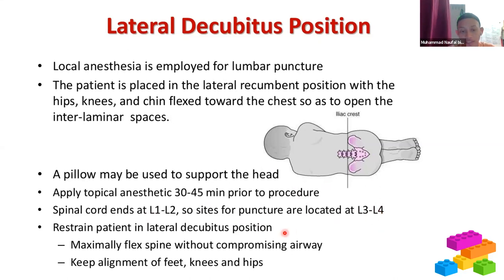And then restrain the patient in lateral decubitus position to maximally flex the spine without compromising the airway, and also keep alignment of feet. The patient also has to keep alignment of feet, knees, and hips. Okay, next.